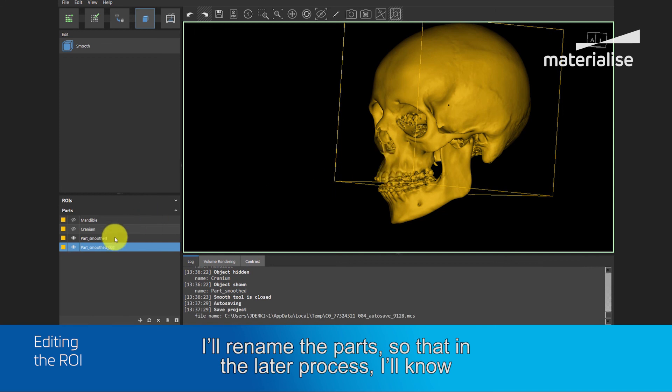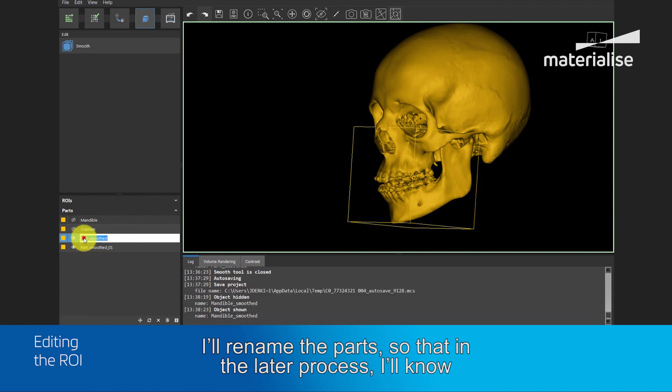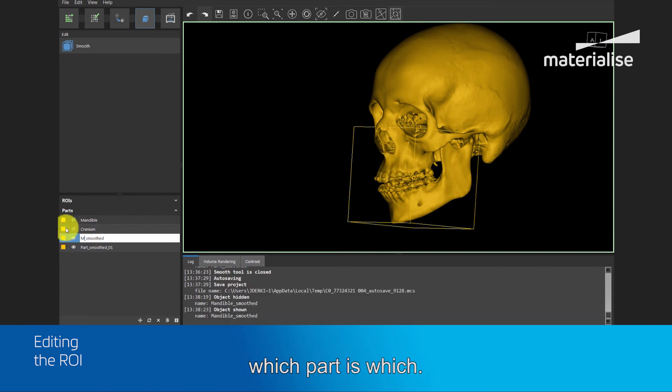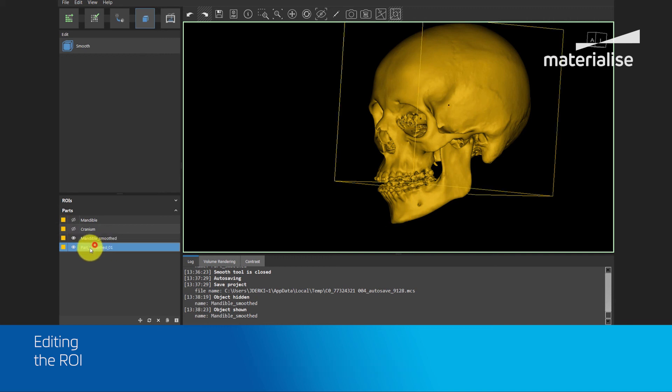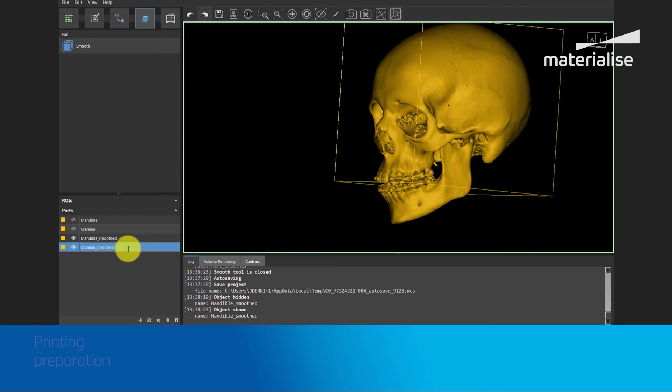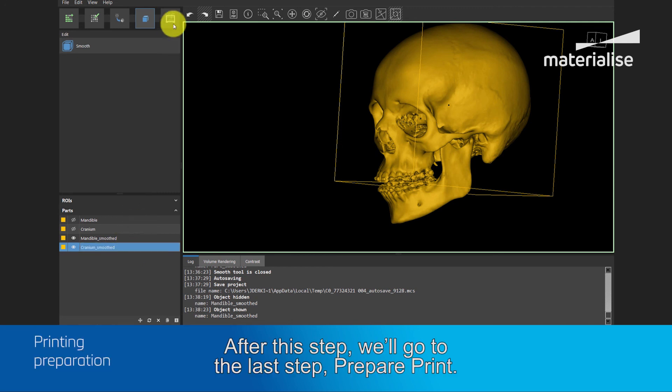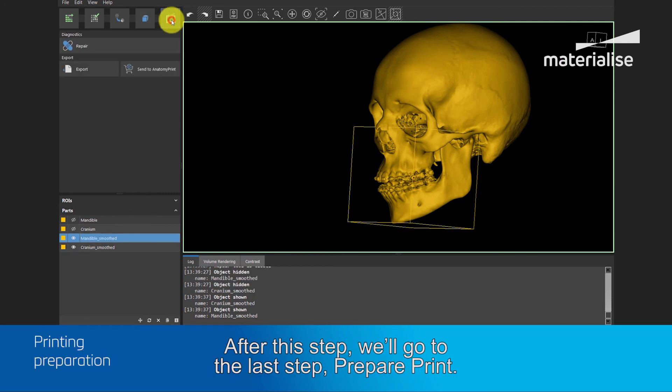I will rename the parts, so that in a later process, I know which part is which. After this step, we go to the last step, Prepare Print.